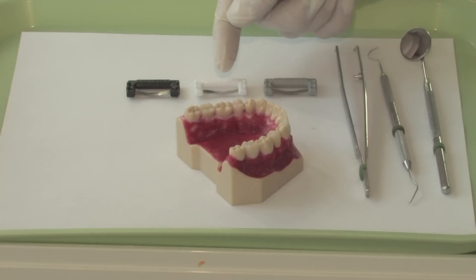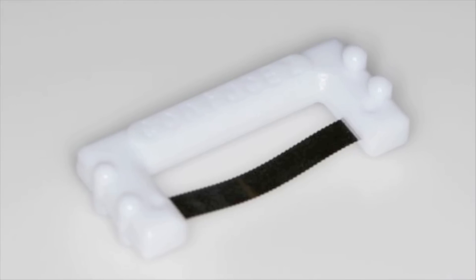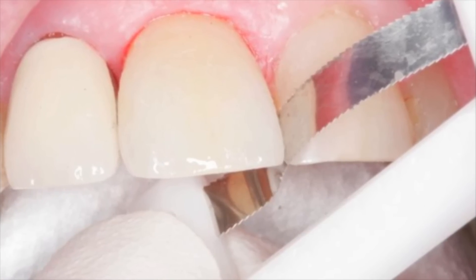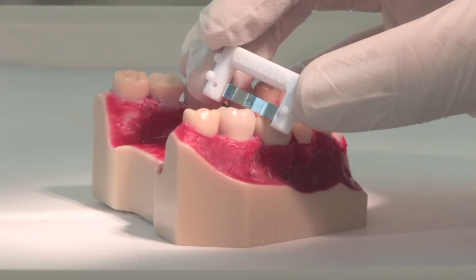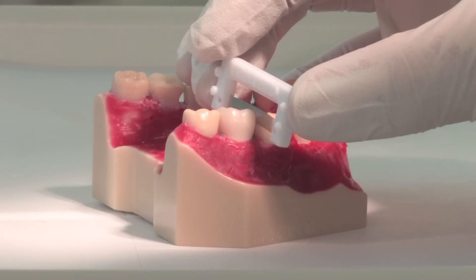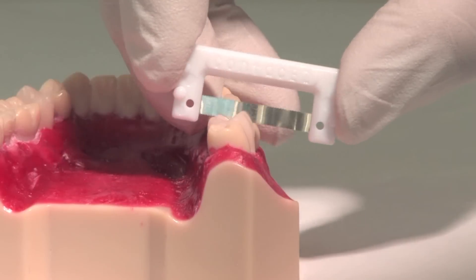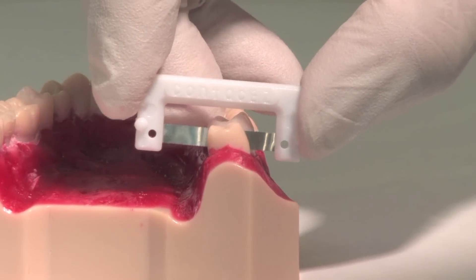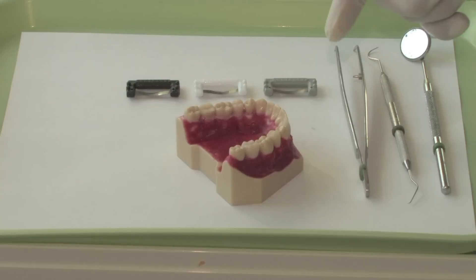The second step is to use the ContactEasy Serrated Dental Strip. It is even thinner, with saw teeth that cut and clean out the remaining cement pieces in the interproximal spaces safely, without soft tissue irritation. If you need more rigorous cutting and cleaning after cementation, use the ContactEasy Serrated Dental Strip too, a more heavy-duty dental saw.